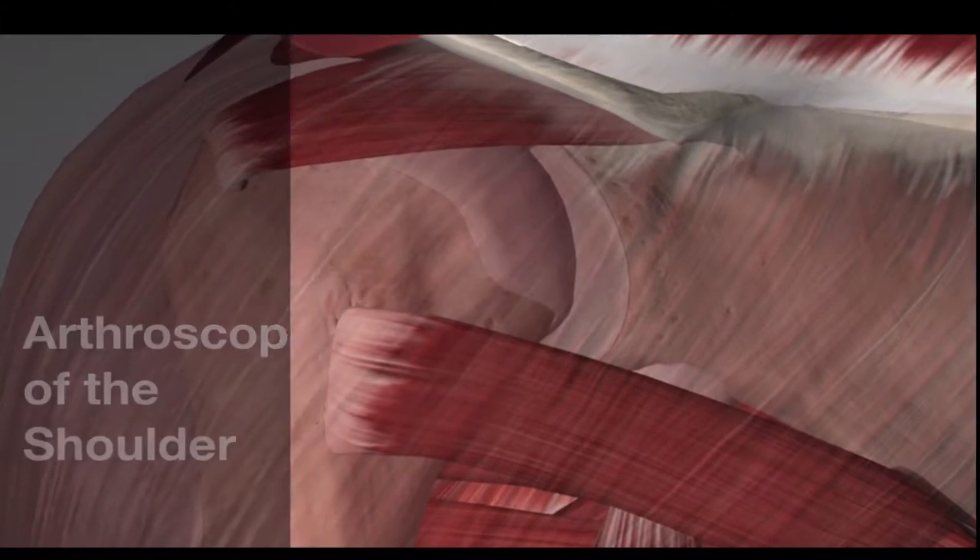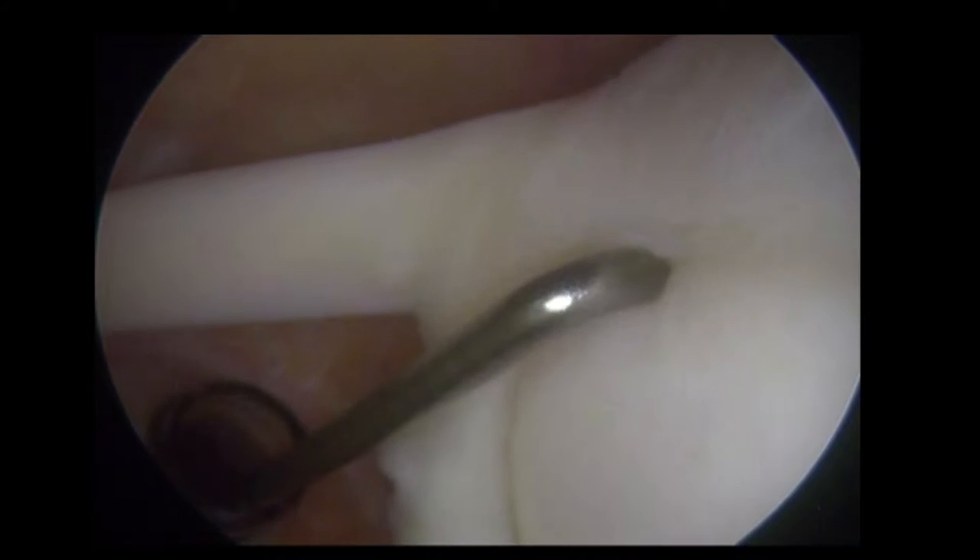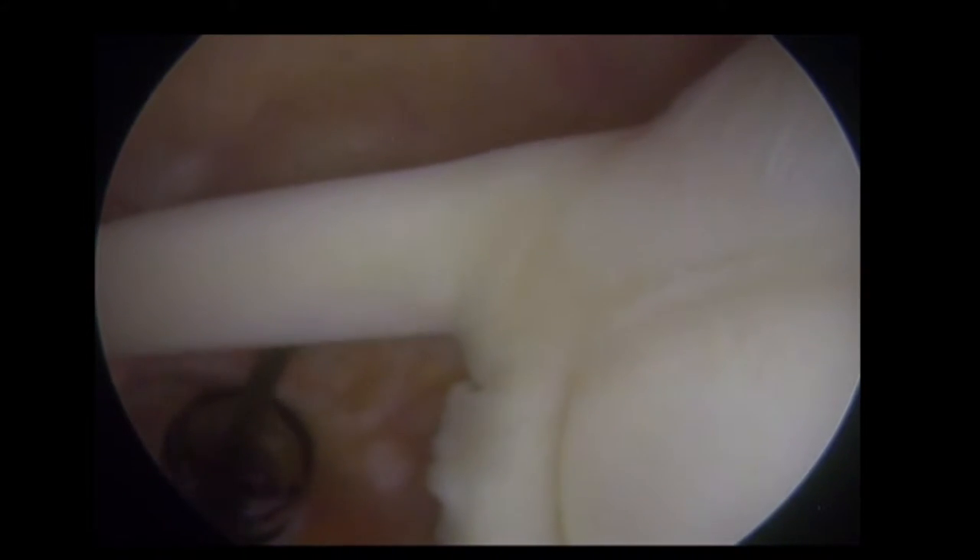Arthroscopy of the shoulder. The scope has been inserted posteriorly and the superior labrum appears stable to probing.